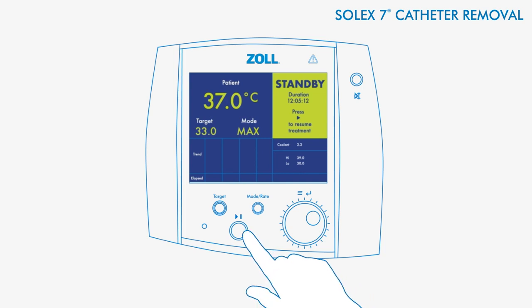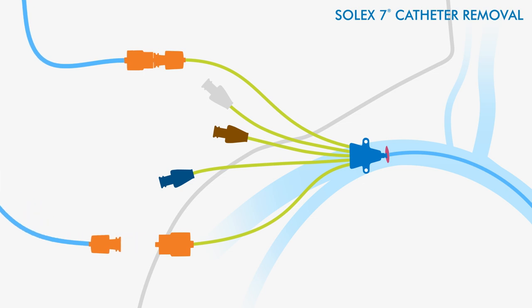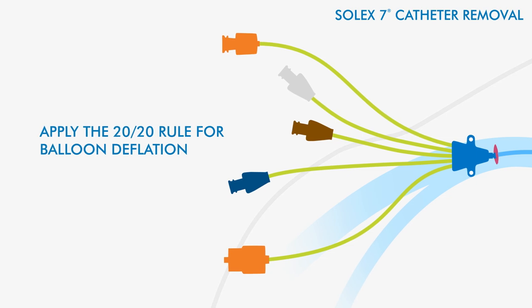Place the console into standby mode. Remove the sutures from the catheter. Disconnect the startup kit lumens from the catheter. Apply the 20-20 rule for balloon deflation.